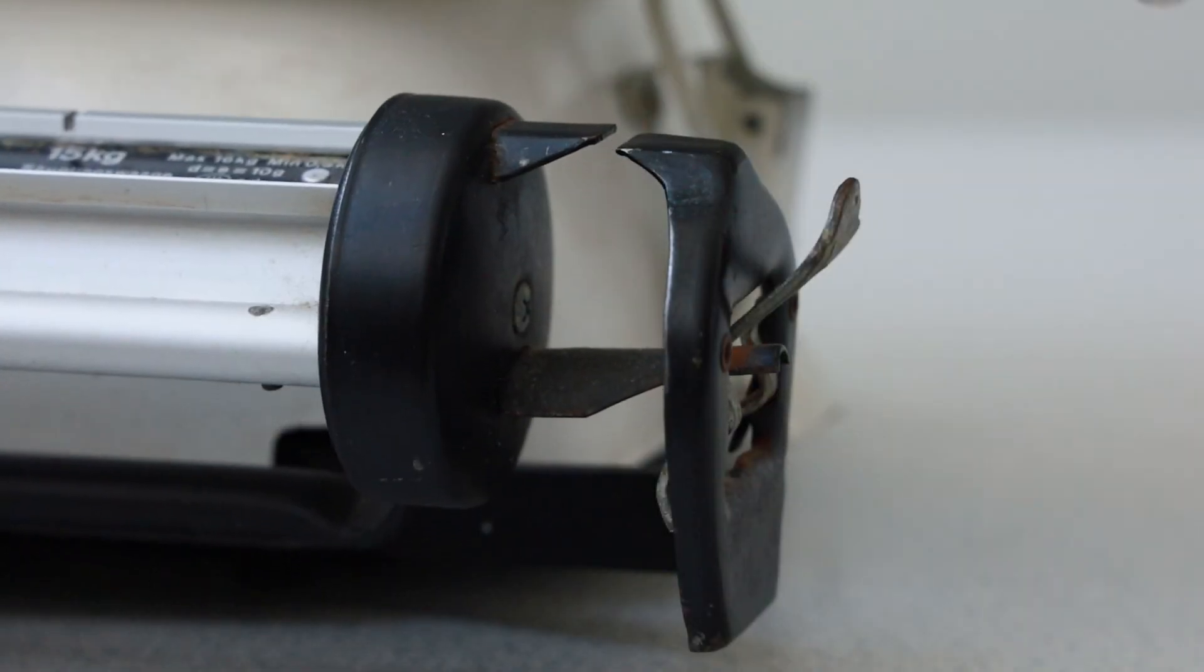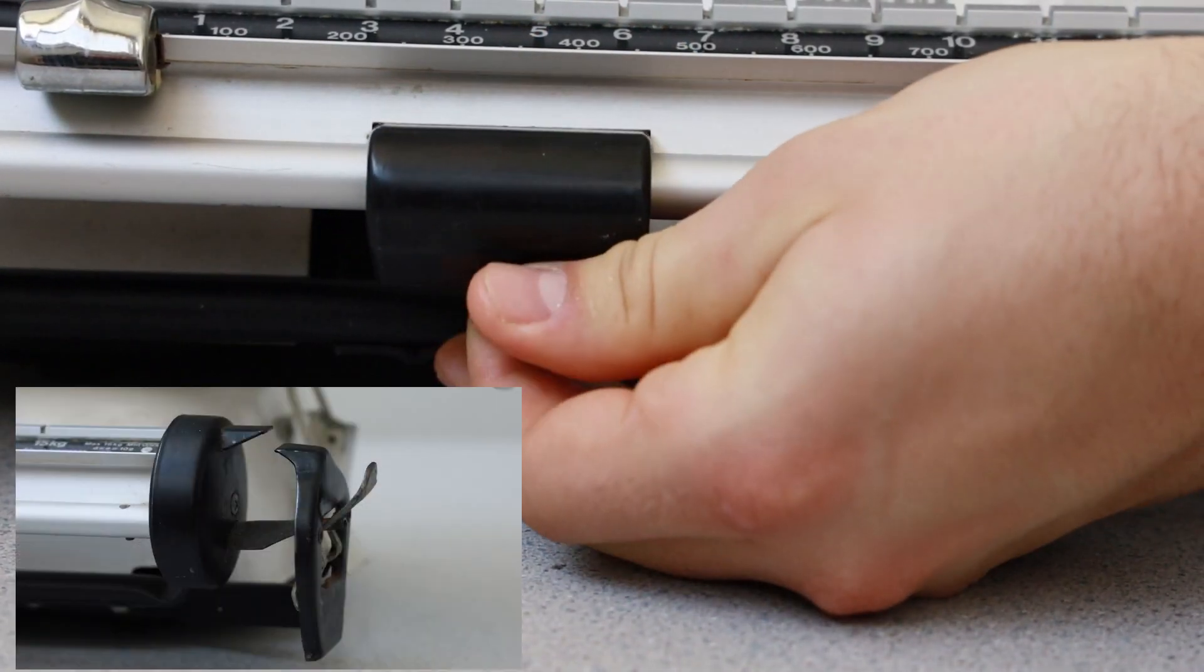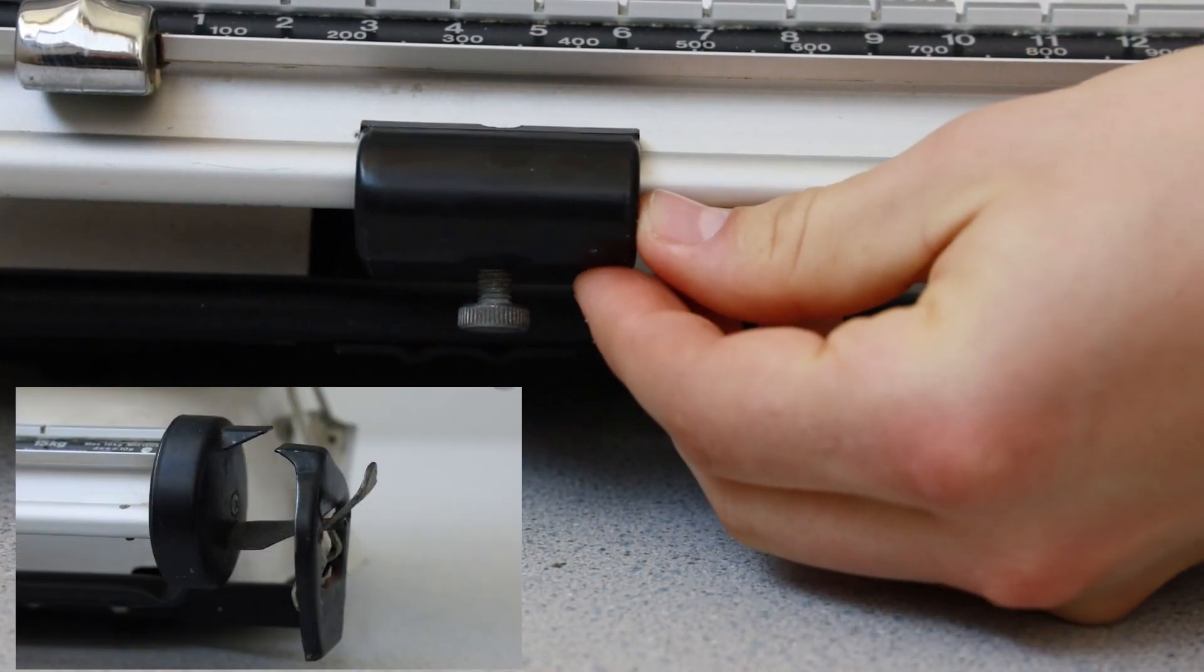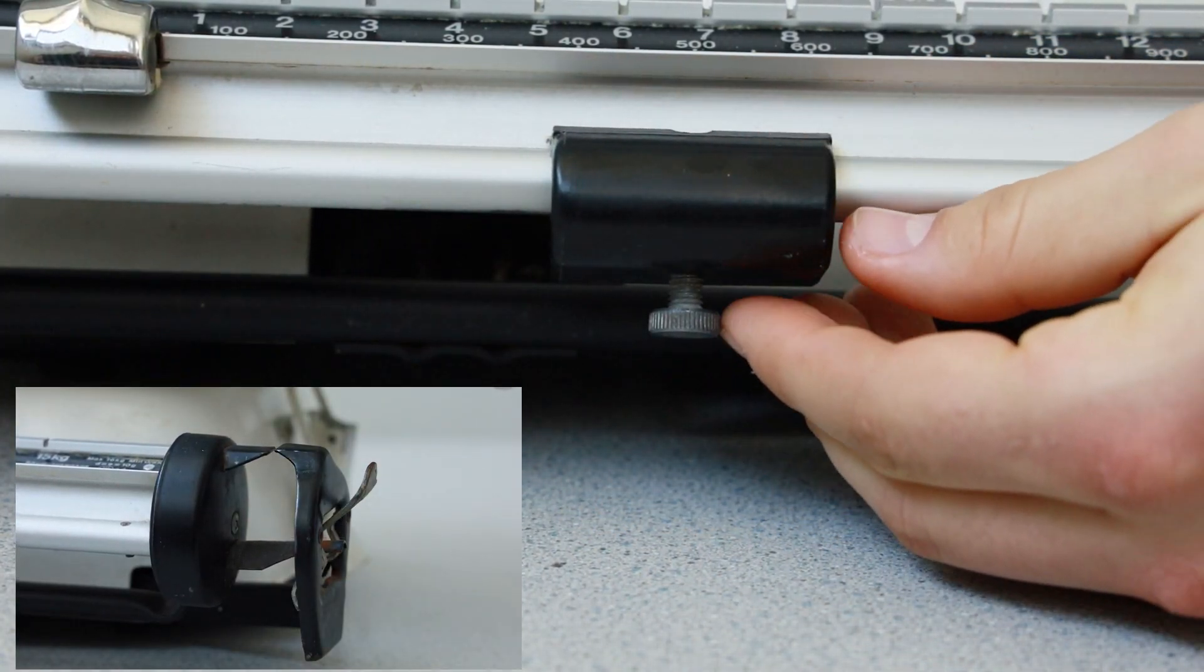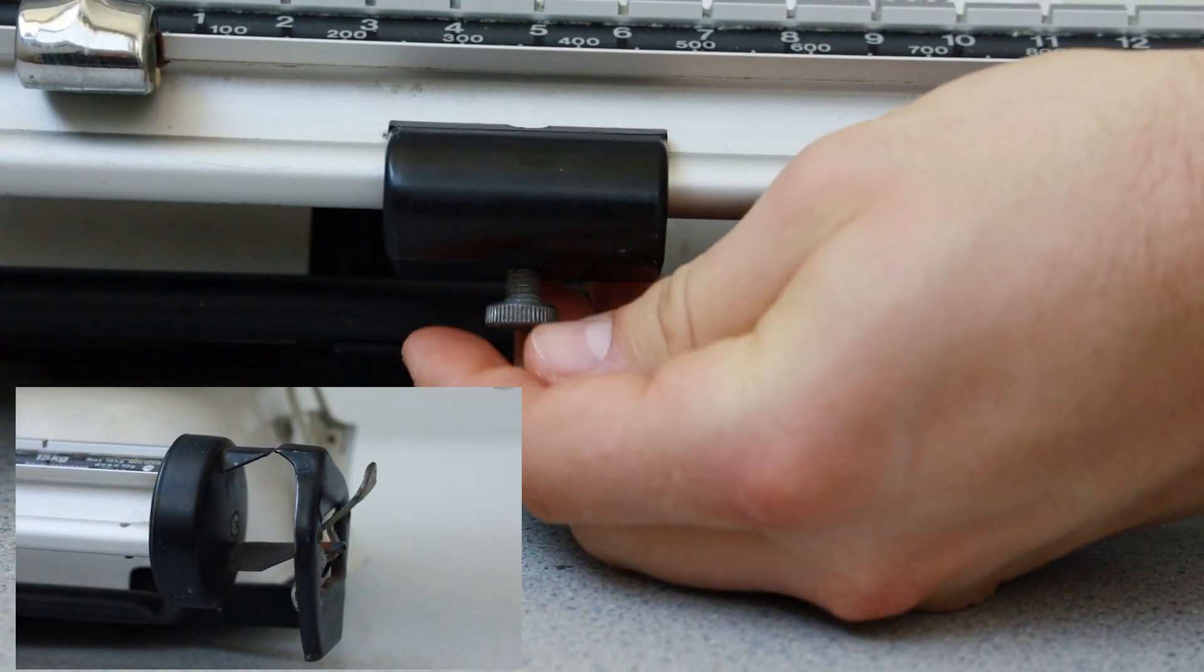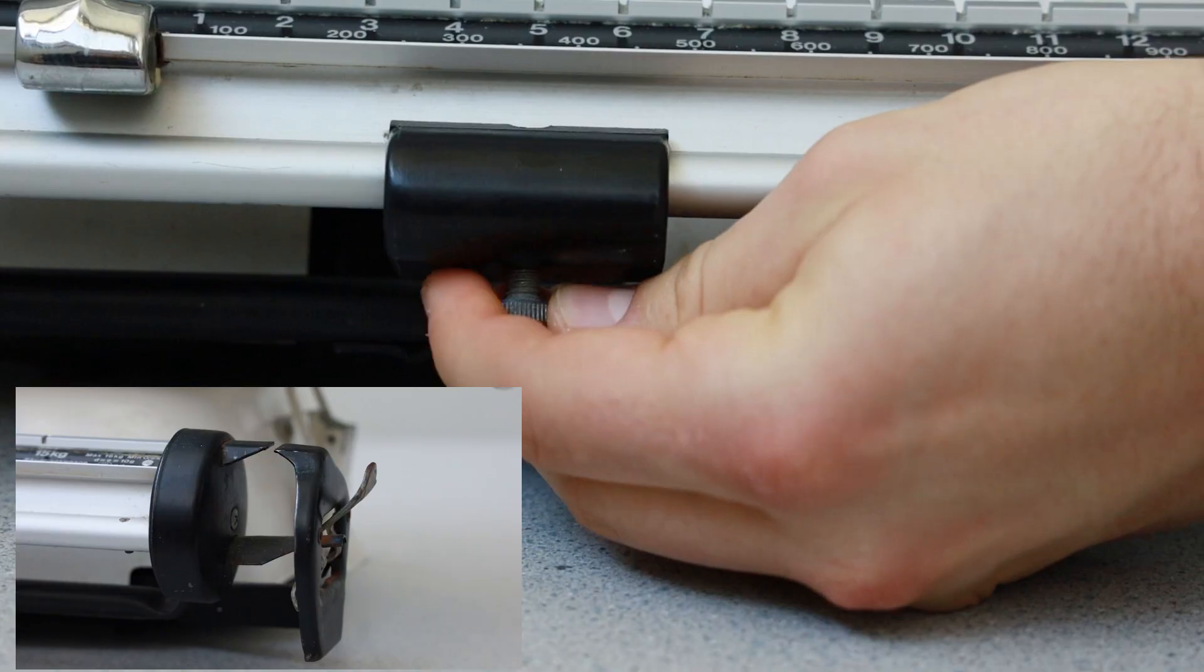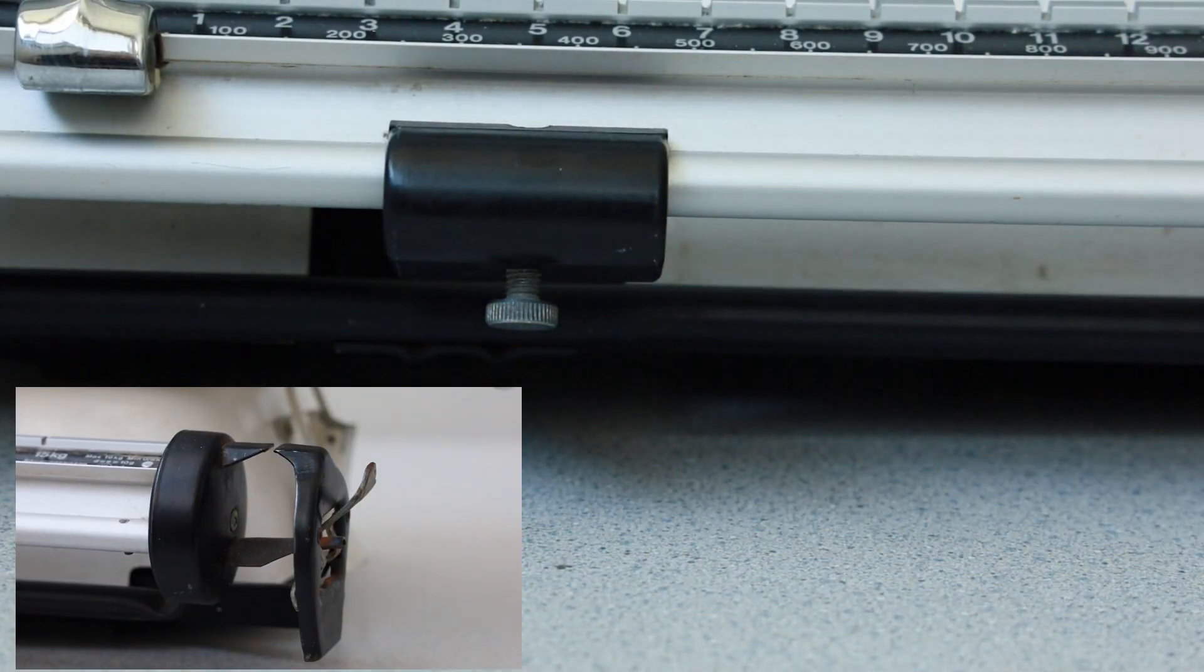If the balance beam is not level without any weight present in the basket, move the tear weight by unscrewing it and sliding it back and forth until the beam balance is level. When the beam balance is level, indicated by the pointer and counter pointer being aligned, screw the tear weight back into place so it does not move. The scale is now calibrated and can be used for weighing.